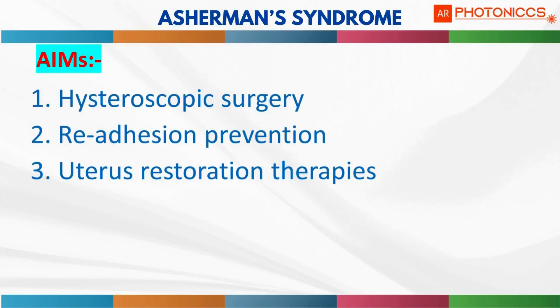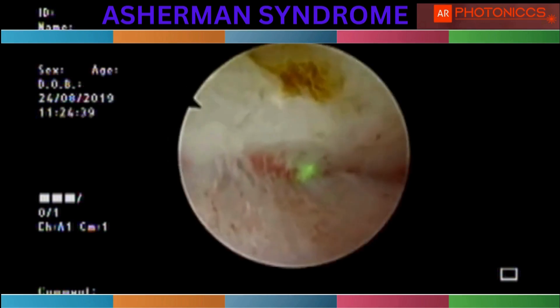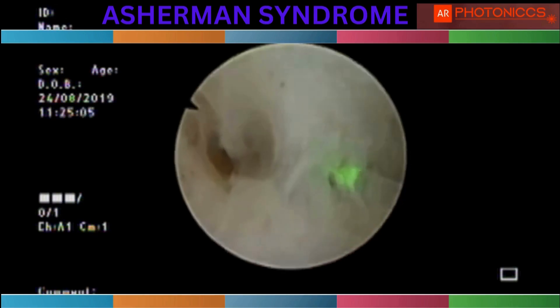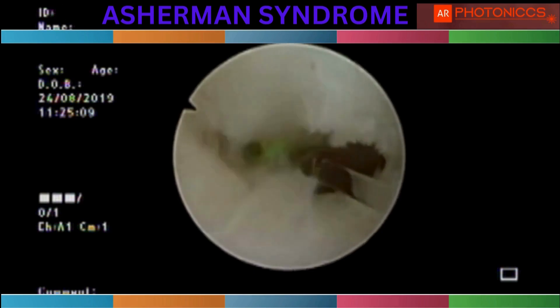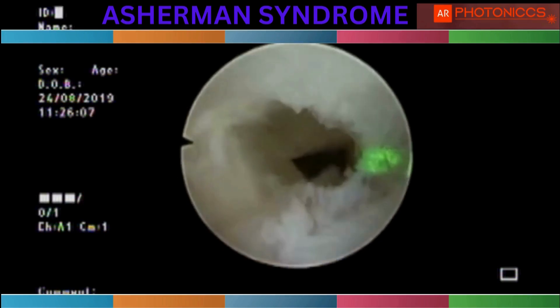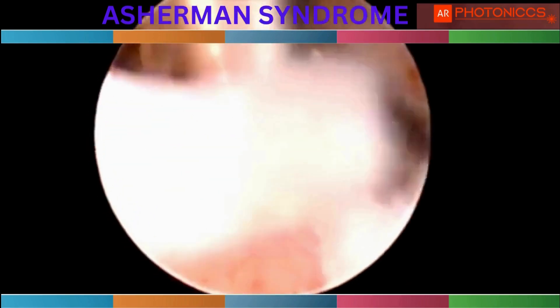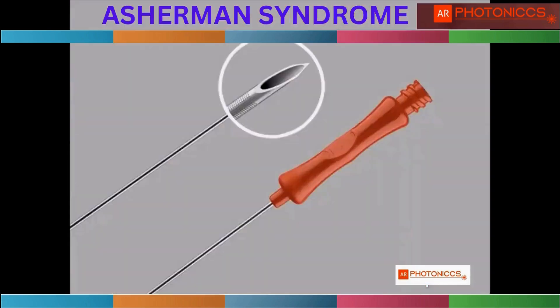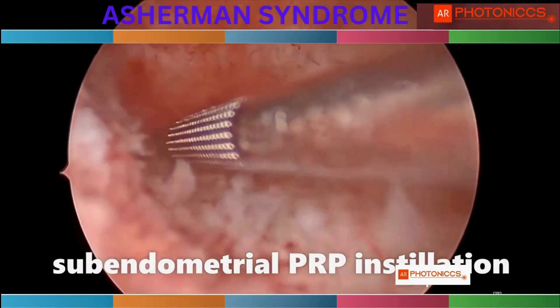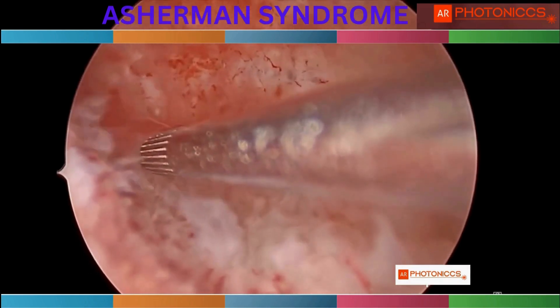You can see how the bed looks after this procedure — it is very specific. Coming to Asherman syndrome: for intra-uterine adhesions, we use the laser here. You can use holmium laser, thulium laser, or even diode laser. More watts are required here. You see how the white fibrous bands are being cut. We use the laser, forceps, and sometimes scissors. After cutting with the laser, the flimsy bands can simply be cut with cold scissors or even forceps. After clearing the entire endometrial cavity, you take an ovum pick-up needle and prepare PRP — platelet-rich plasma — and inject sub-endometrially at four spots: anterior, posterior, and lateral.